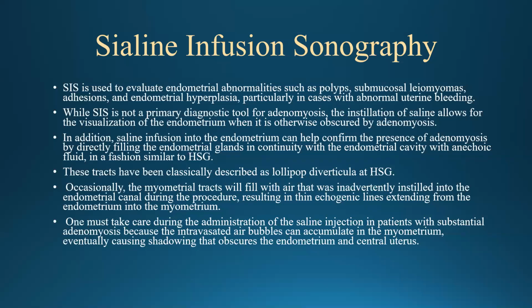I'm going to show you some pictures. They are beautiful in demonstrating lesions inside the endometrial cavity. It's not a primary diagnostic tool for adenomyosis though. The installation of saline allows for visualization of the endometrium when it's otherwise obscured by the adenomyosis. In addition, it can help to confirm the presence of adenomyosis by directly filling the endometrial glands in continuity with the cavity, as I will show you in these upcoming pictures.